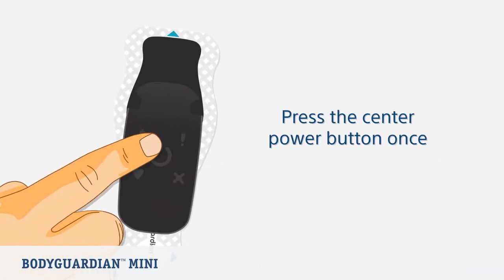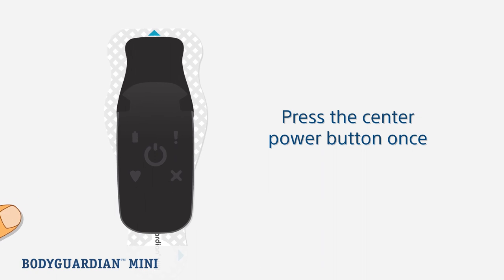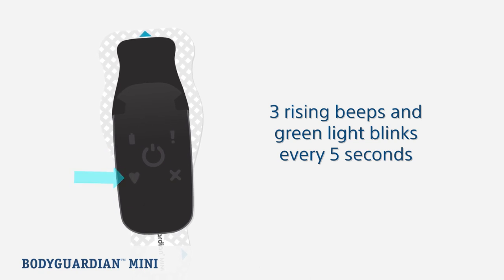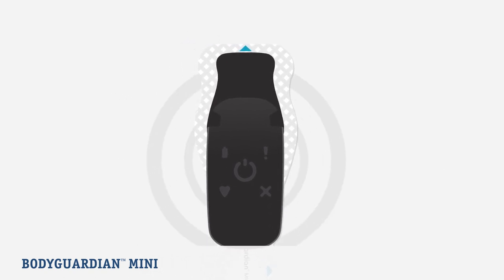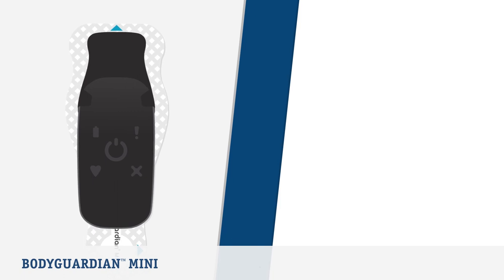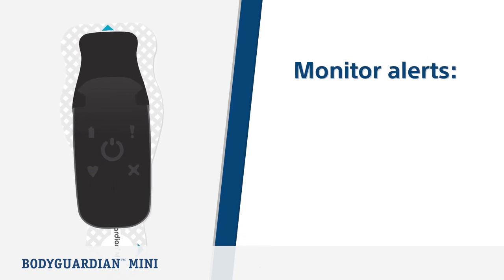Now let's look at turning on the monitor. Turn on the monitor by pressing the center button once. If contact between the strip and your skin is satisfactory, the monitor will make a quick series of three rising beeps and the green light blinks every five seconds. This tells you that you are successfully being monitored.